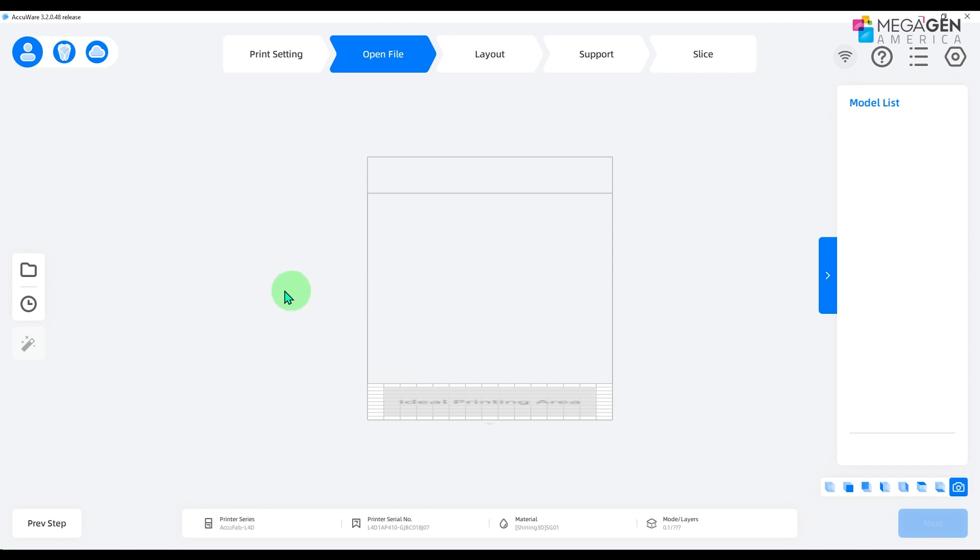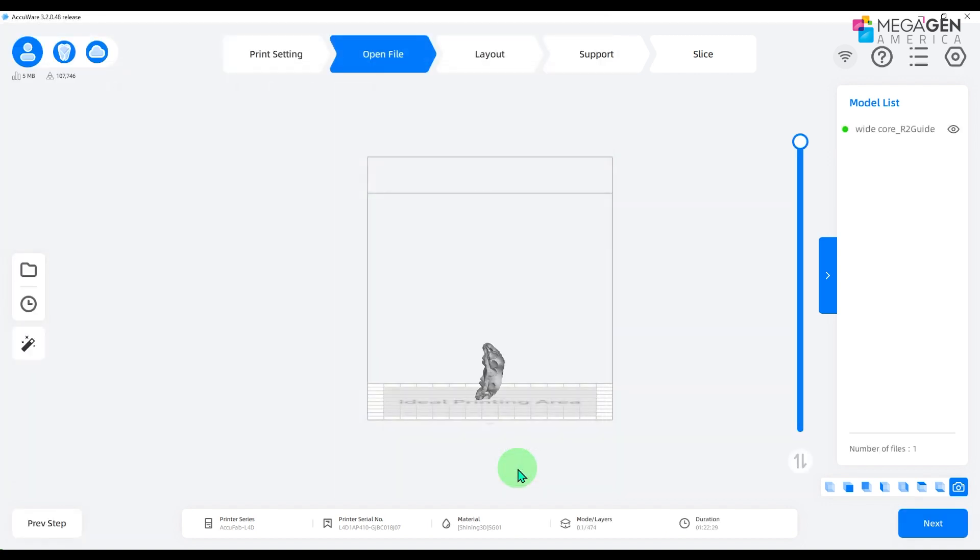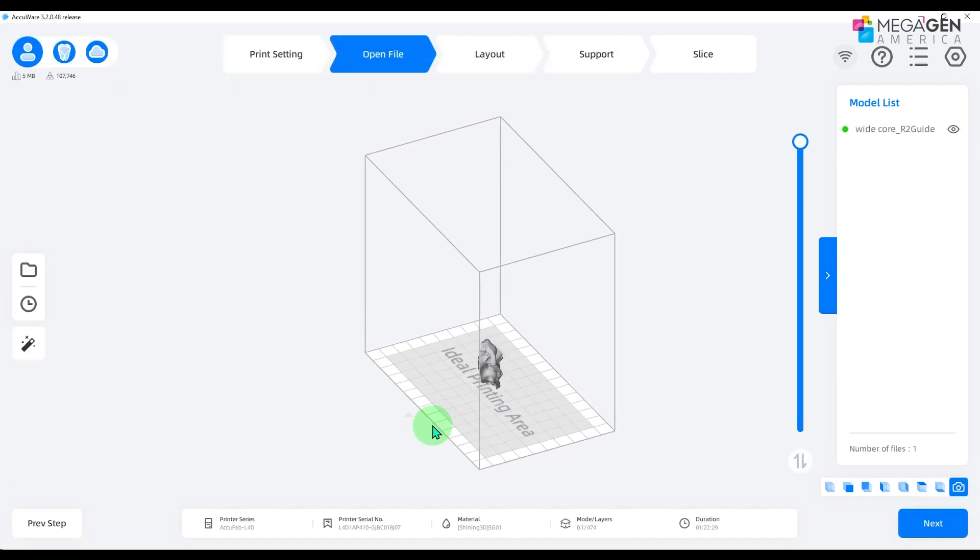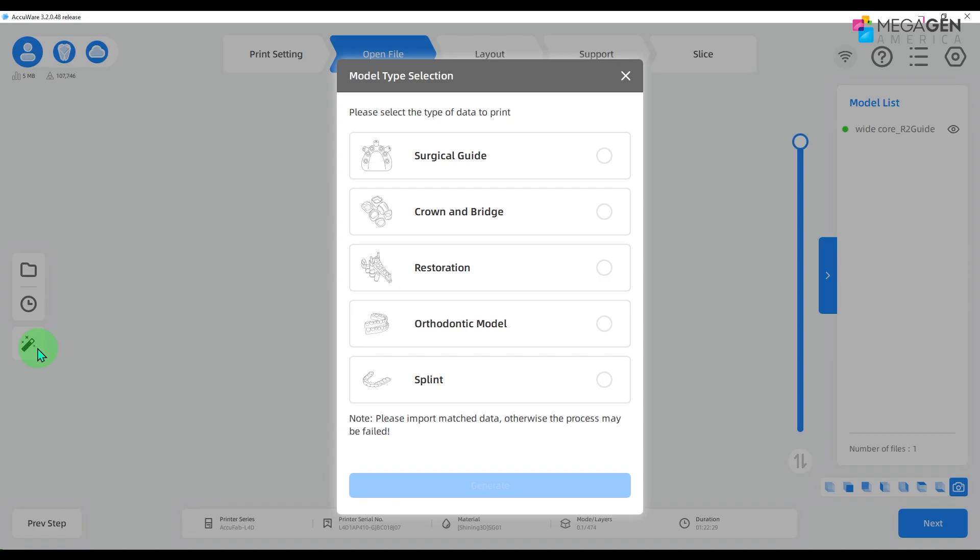Go to open file at the top and choose the folder icon on the left. Bring the STL file of the surgical guide and click on the magic wand icon on the left. That will automatically place the supports for you to proceed with printing.